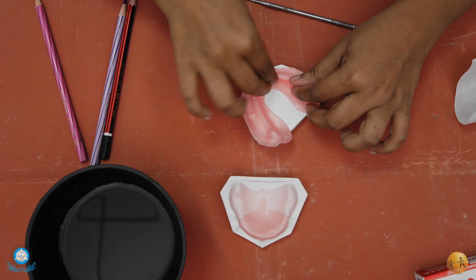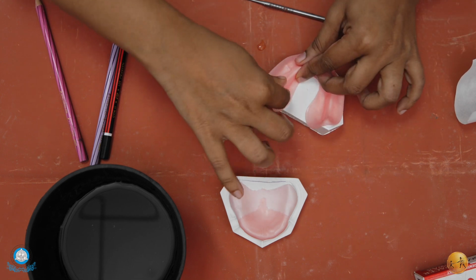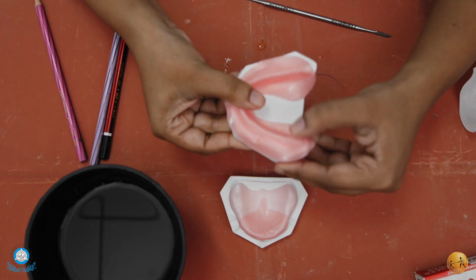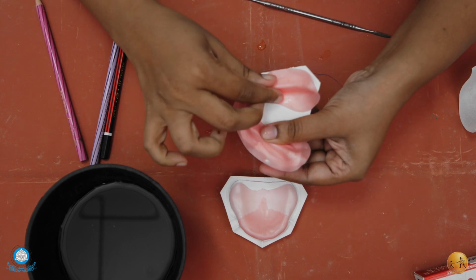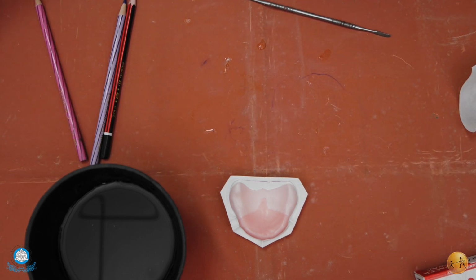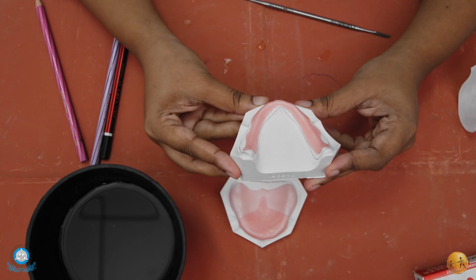Once your spacer is well adapted to the cast, you can see the dotted lines and you are supposed to cut the spacer along the dotted lines. After cutting it along the dotted line, relieving the buccal shelf area, the spacer is going to look like this.